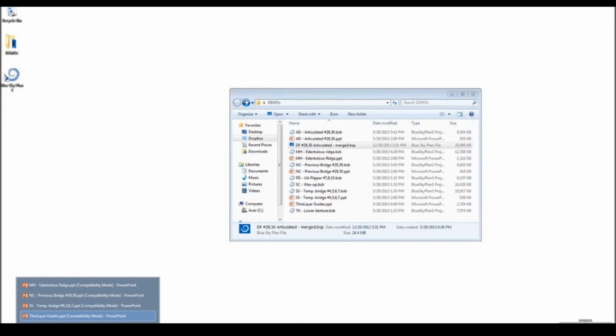When you do an optical merge and you're trying to find an incisal edge or some contour of a cusp tip, there are several points to triangulate in order to achieve your merge. If there's a significant amount of scatter, there's a risk that the merge is inaccurate, or that some of the companies will clean up your scan for you. My personal feeling is that may not be a very accurate exercise. Because we do it this way, scatter has no relevance to our merges. Was there a second part of that question?